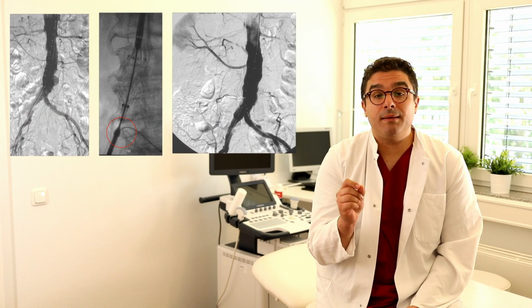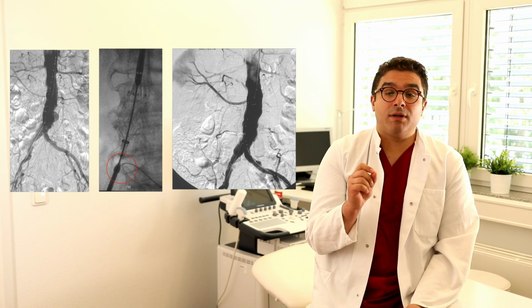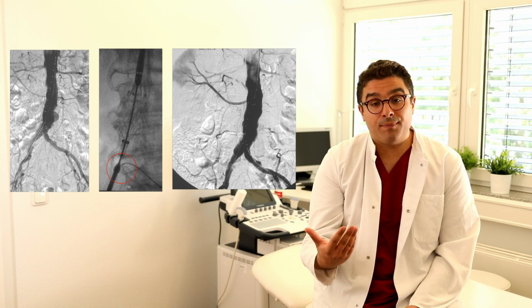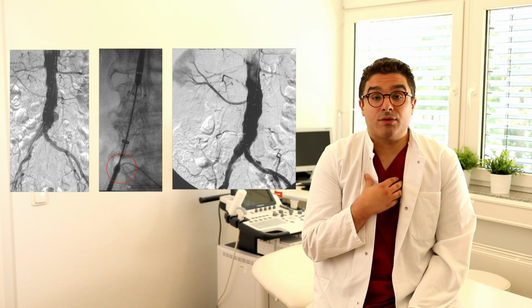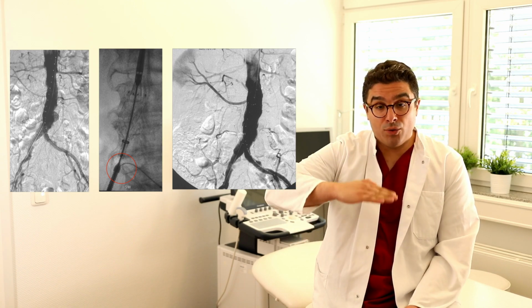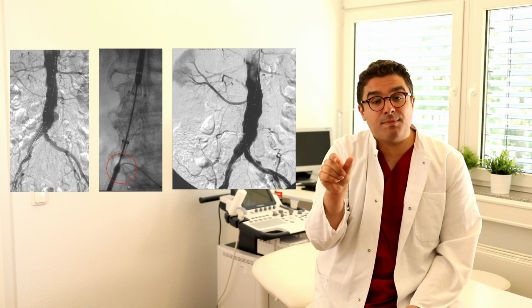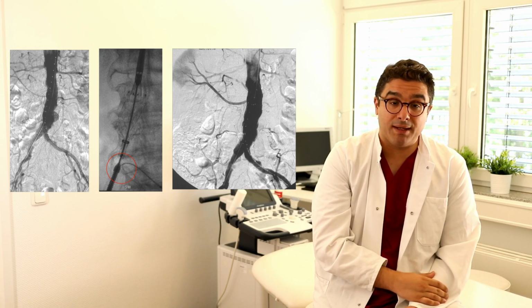Last but not least, a specific device is also the tube endograft, which is available only by a few companies. The only indications for the tube endograft is the penetrating aortic ulcer of the infrarenal aorta or the aortic stenosis. Our recommendation here is to start from the aortic bifurcations to the renal artery by implanting as many tubes as necessary with 3 stents of overlapping.